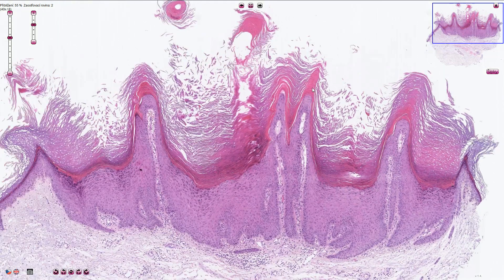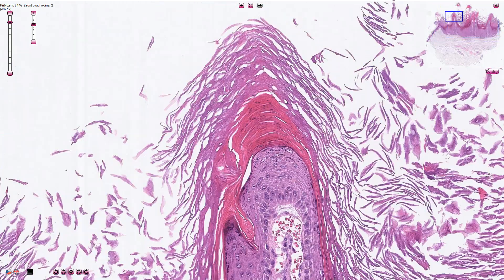The parakeratosis is typically localized above the tips of the papillae, which is sometimes described as a coniferous tree appearance, or the Christmas tree if you like, with these bulbs. Here we have the retained nuclei in the keratotic layer, which is a sign of parakeratosis.